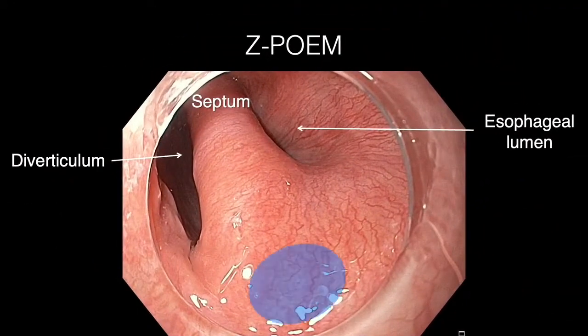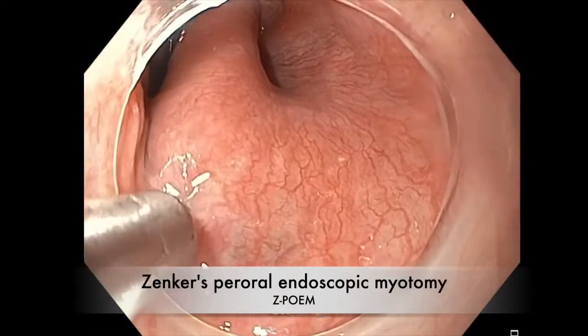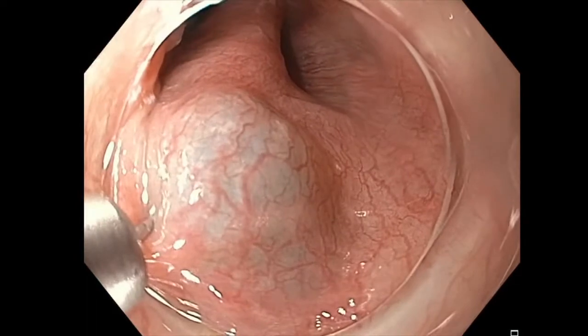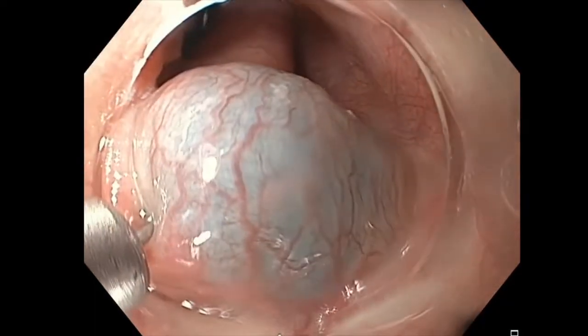In a Z-POEM, a submucosal injection followed by a mucosal incision is performed 1 to 2 cm proximal to the septum. Submucosal tunneling is then performed until the septum is exposed, allowing a complete myotomy. As an incomplete myotomy is felt to be a large contributor to recurrence following standard septotomy, this theoretically reduces the risk of recurrence. Here, a submucosal injection is performed 1.5 cm proximal to the Zenker septum to create a mucosal bleb. We use a premixed solution of indigo carmine and normal saline.